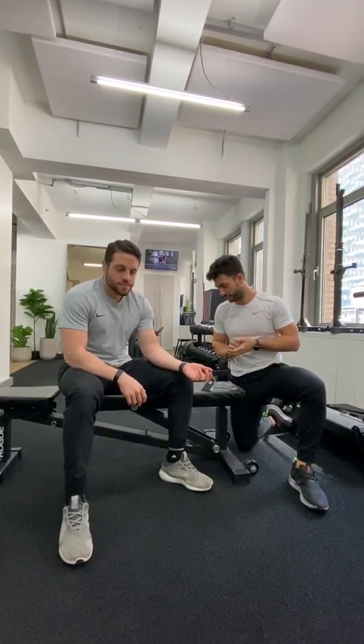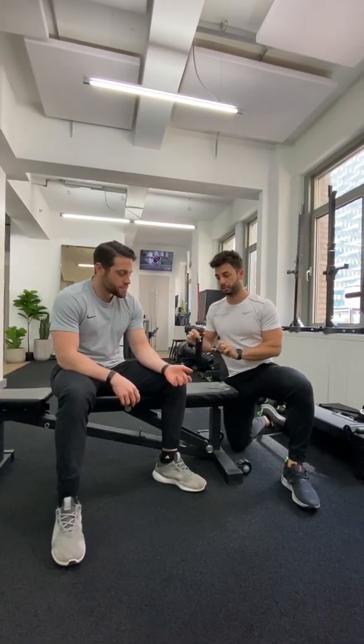Hey guys, Dan Giordano here from Bespoke Treatments. I'm here with Sam today from Bespoke Treatments. Sam's having a little medial elbow tightness on the side, so we're going to use kinesiology tape to increase the blood flow, help monitor the pain a little bit, let the tissue heal itself, and get him back to lifting as strong as possible. We're using the pre-cut Mueller kinesiology tape strips.